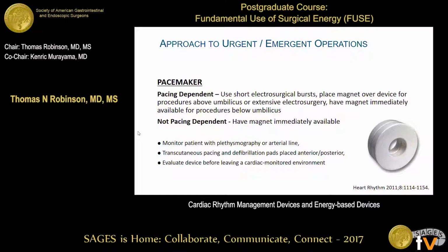So based on those two pieces of information, we're going to go into what you actually do. I put a picture of a magnet here. Who here has used a magnet in the OR? A lot of surgeons think that a magnet is a get-out-of-jail-free card. It's like, just put the magnet on it and it'll be fine. I think there's something to that, but I'm going to explain what the magnet does, because magnets work differently on pacemakers than they do on cardioverter defibrillators.